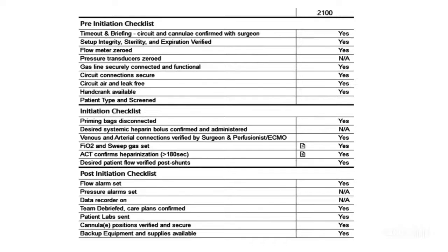That is very important. There are simulators which we can use, or there can be practical hands-on sessions on mannequins, which will help you to prepare for these kinds of emergency situations. You can always have some kind of support from the surgeons in case any bleeding occurs, and percutaneous procedures can be converted into open procedures. And for any bleeding, we need good support from the blood bank and blood products like PRBCs, FFPs, and platelets, which can be transfused. So these are all things which become very, very important in preparing yourself or your team for ECMO.